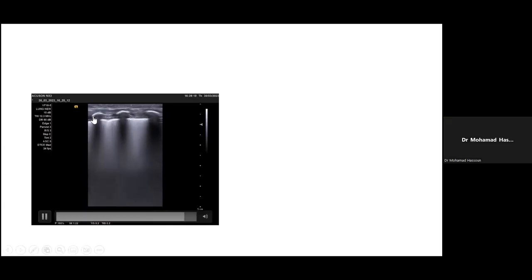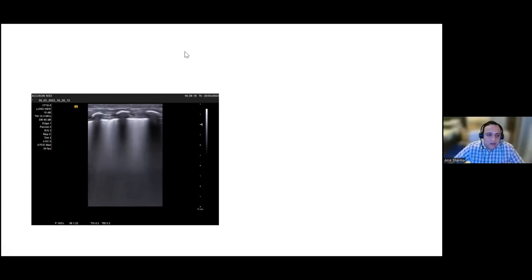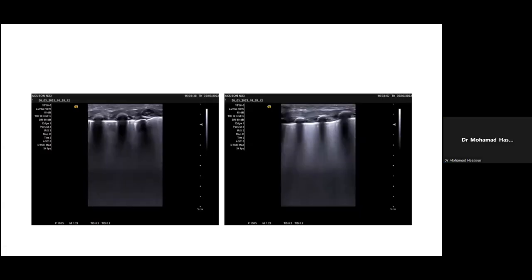And we have this subpleural consolidation. I don't know if we should consider it here a shred sign or fractal sign. No, I wouldn't. I will show you a lot of shred sign today. I would consider that just a subpleural consolidation with a little bit of microatelectasis. Shred sign would be a deeper area of consolidation and classically very irregular margins. This is a subpleural consolidation, a little bit of microatelectasis. You can just see the pleural margin dropping back.